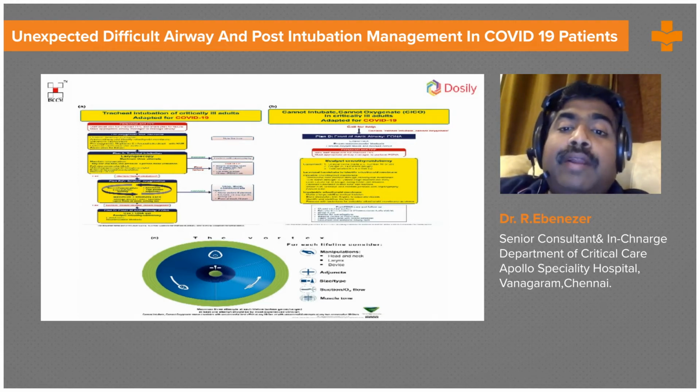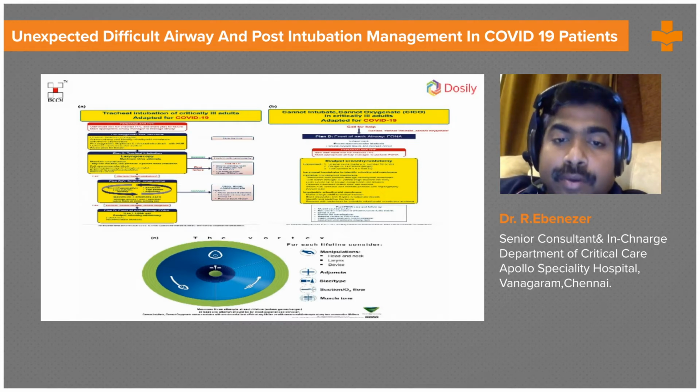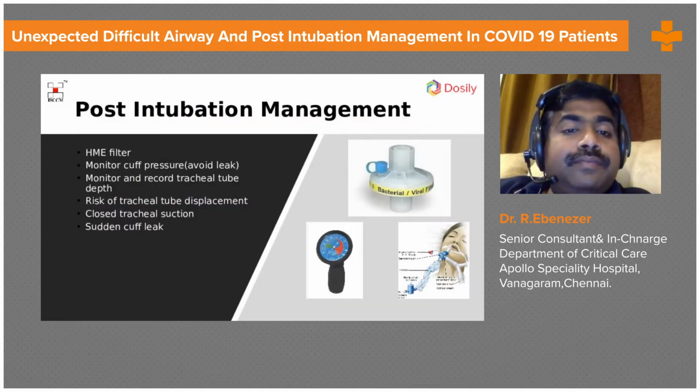Cannot intubate. I'm not able to intubate, sir. I'm not able to oxygenate, sir. What do I do? You go for your scalpel cricothyroidotomy set. Okay. Next, what do I do post-intubation?